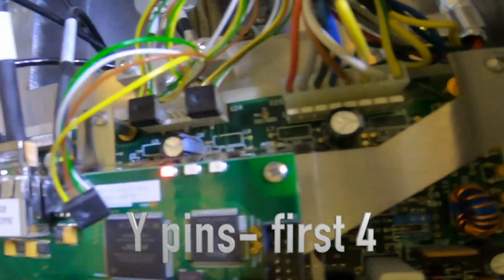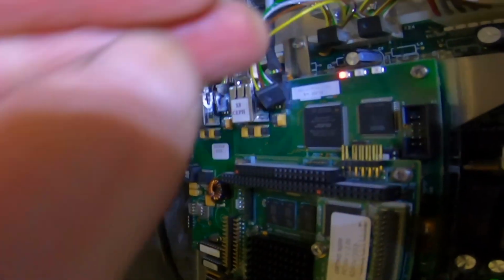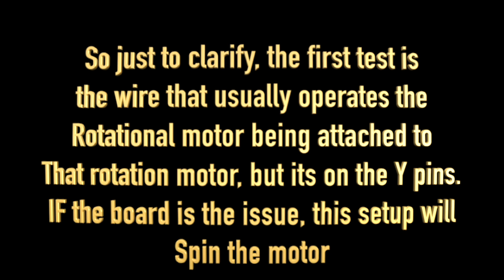So what I did was I took the 4 from the middle, which was the R wire. Again, what we have here is the R wire connecting the R motor, utilizing the different pins on the circuit board. So if the pins on the circuit board are the issue, this should work.